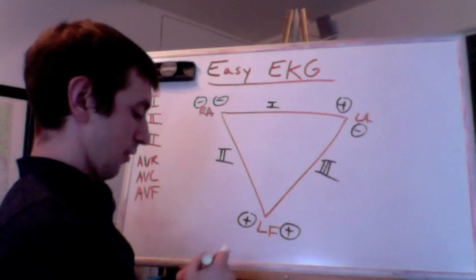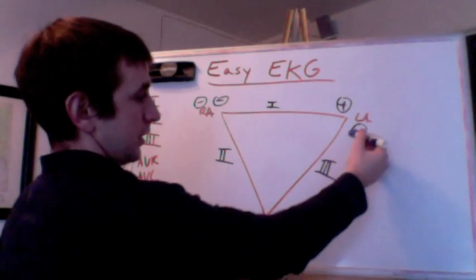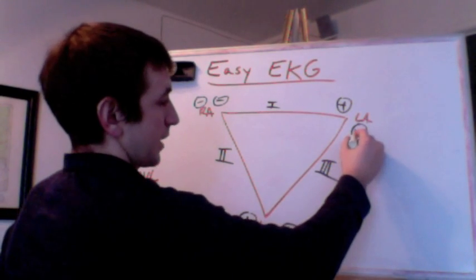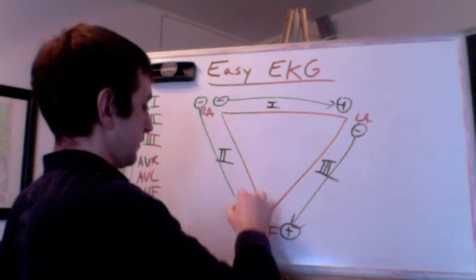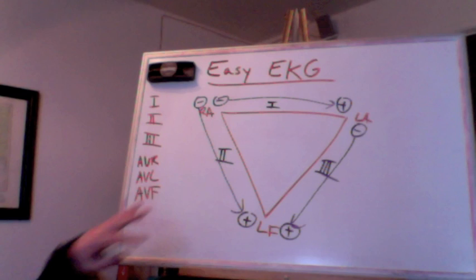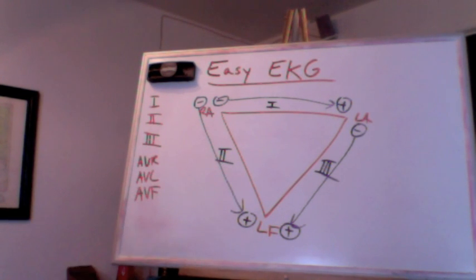So essentially the electrodes go from, just like in a circuit, connect negative to positive, so this direction here. Okay, so lead 3 is that, lead 1 is this, and lead 2 is this. So this is what you know. This is Einthoven's triangle. I'm sure you guys have gone over it.